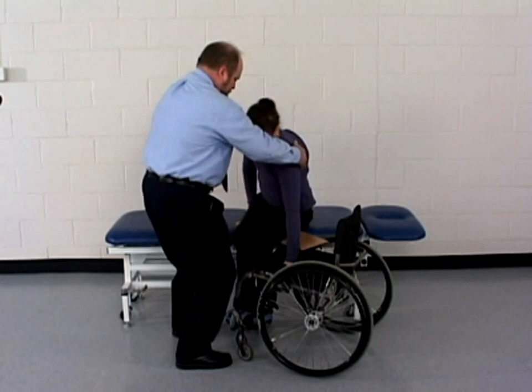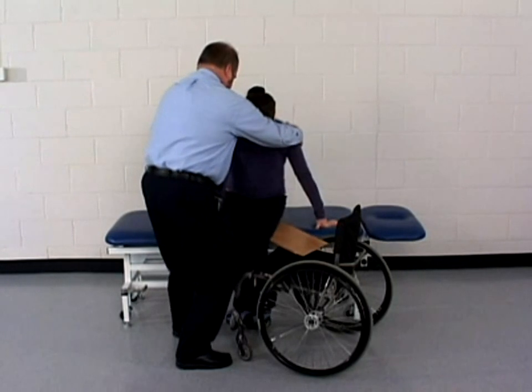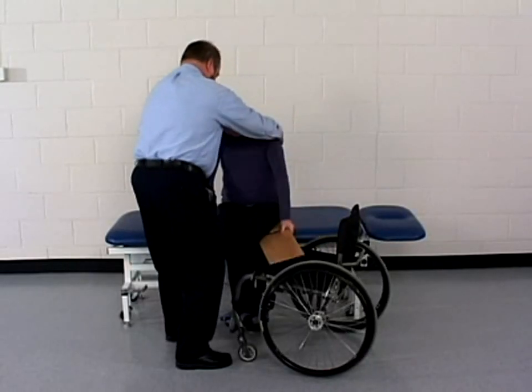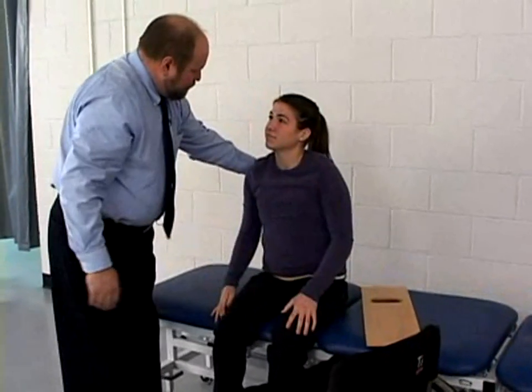At any time, the therapist can assist the patient by lifting with his hands under the patient's buttocks. Make sure that the patient never grasps the edge of the sliding board as her fingers may be pinched. The patient leans away from the wheelchair to remove the sliding board. The therapist doesn't release the patient until the patient is in a position that can be maintained independently.